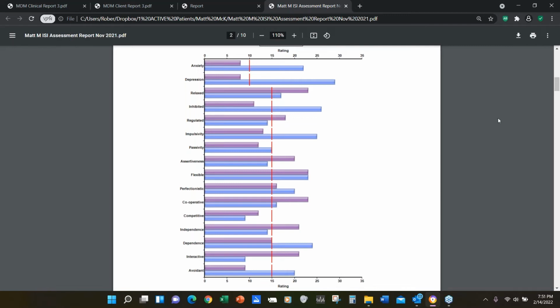If someone has a methylation problem and their brain looks like it's sleeping, if you don't look at that, or if someone has an iron problem, you can do neurofeedback, but their brains may not be able to respond. So my main focus is to see what it looks like in the map. If I'm thinking, wow, there's a sleep deficit here, or maybe there's a methylation issue, I say, look, we have to look at the physiological and take care of it.